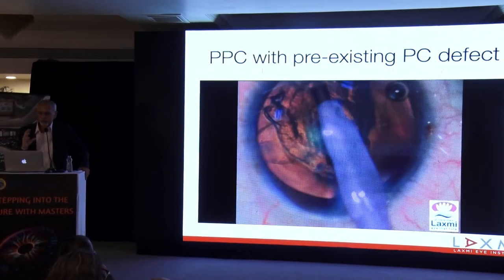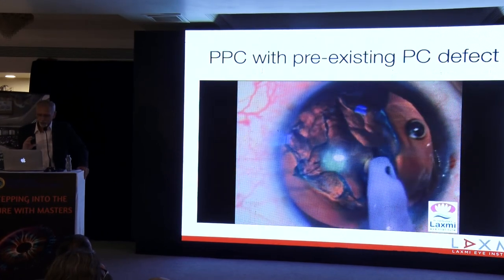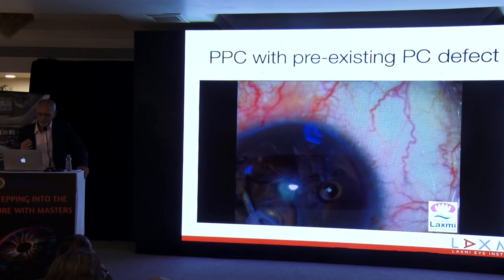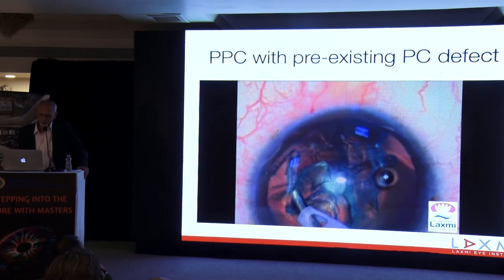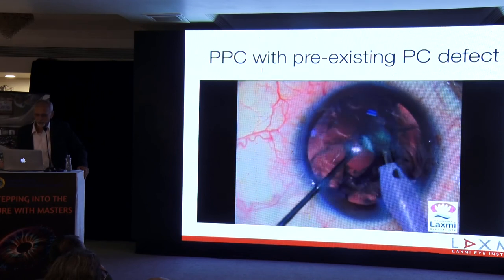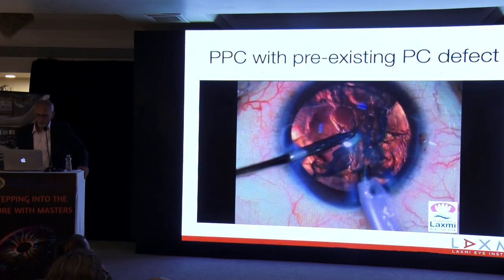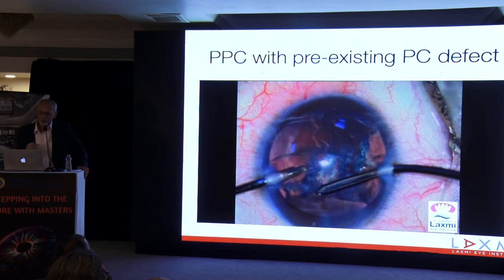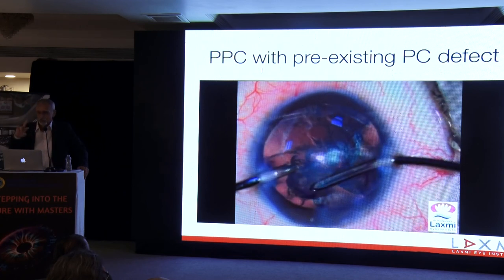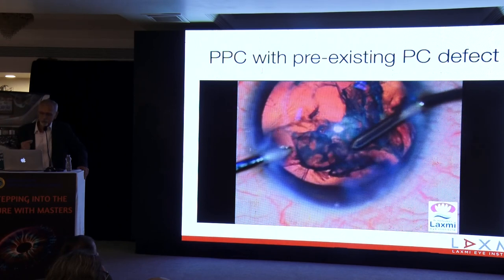This is where your phacodynamics comes to your rescue extremely well. Here I am doing what I call in situ four quadrant. You create a very superficial trench, you create a trench sideways, and then basically you are doing phaco aspiration where all your parameters are low. Even before the phaco tip comes out, the irrigation has gone in because you don't want your AC to collapse. And even when you want to change hands for a bimanual, you would always take an additional irrigation from this side before this irrigation comes out.